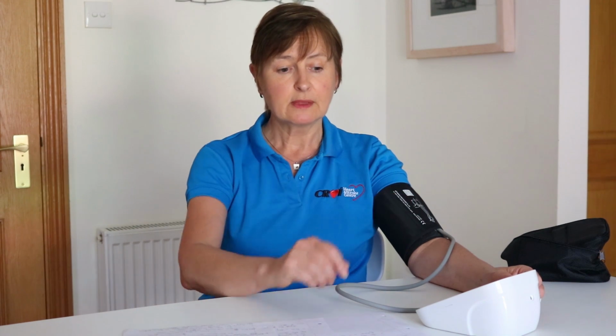We would recommend that you do this for 3 or 4 days in a row, taken first thing in the morning before you take your medications for your blood pressure, and then again in the evening time, about 12 hours later. It's also a good idea to take 2 or 3 measurements so that you get an average, and then document your findings.